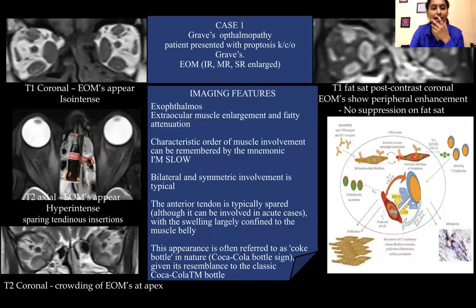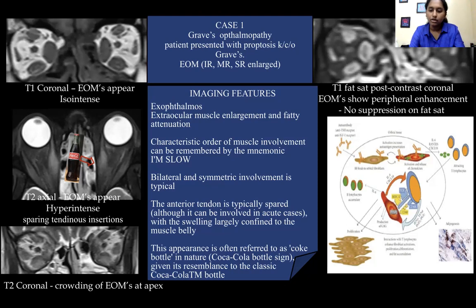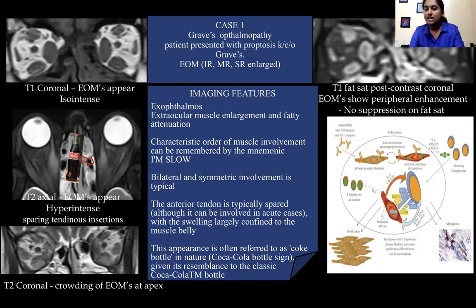On T1 coronal, the extraocular muscles appear iso-intense. On T2 axial images, the extraocular muscles appear relatively hyper-intense, and there is sparing of the tendon insertion — which is one point that differentiates it from orbital pseudotumor, where the tendon insertion would also be involved. On T2 coronal imaging, there is crowding of the extraocular muscles at the apex. On T1 fat-sat post-contrast coronal images, the extraocular muscles show peripheral post-contrast enhancement with no suppression on fat-sat seen within the muscles. However, the orbital fat-containing areas around the extraocular muscles are showing suppression on fat-sat.